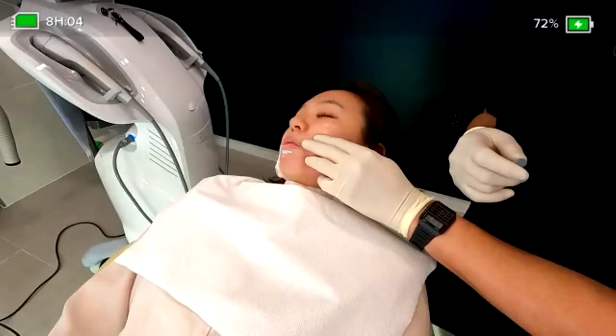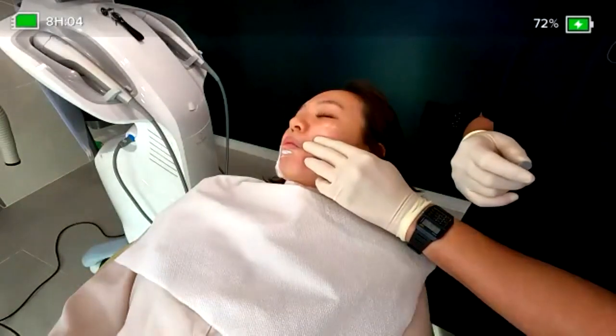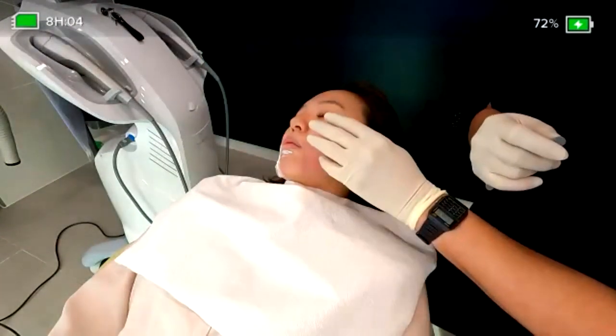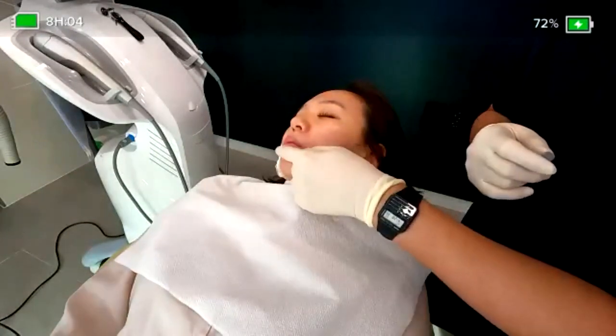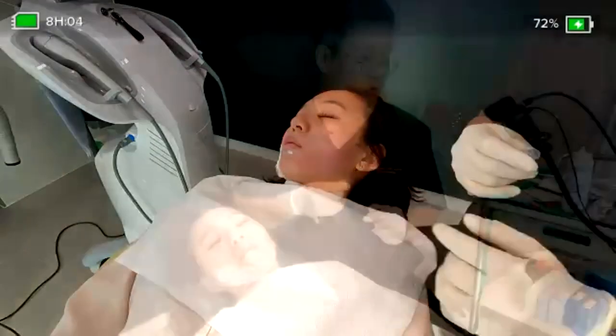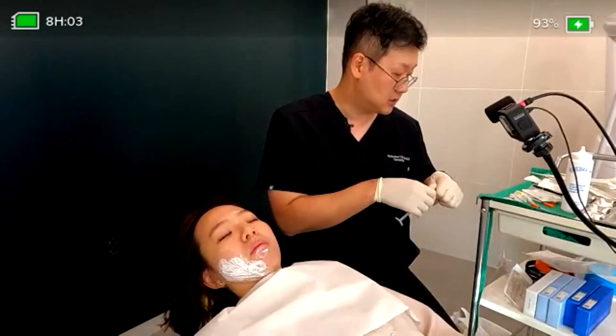So we will inject some filler inside the angles. We want a little bit smiling, but not awkward, and we will make a little bit prominent line here to make a balance for the ratio of the whole lip length.